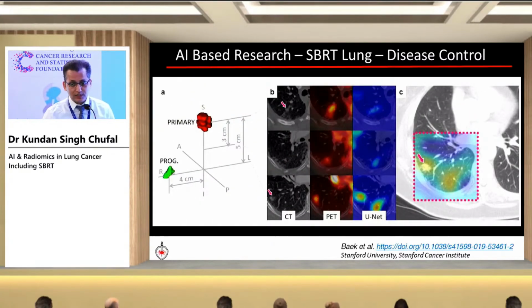The very interesting thing is, if you look at this image, which is the pre-treatment image, at a different slice level. This was the primary tumor here, and there was something here, but it was not found to be significant. And once this patient recurred, the AI algorithm could identify this area, which is highlighted here. So they backpropagated the weights on the basis of which it predicted that there will be a recurrence. And it could actually identify prior to the treatment that there are some areas in the scan which are high risk, and actually the recurrences were happening in those areas.